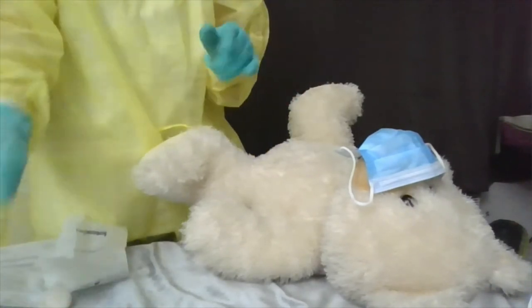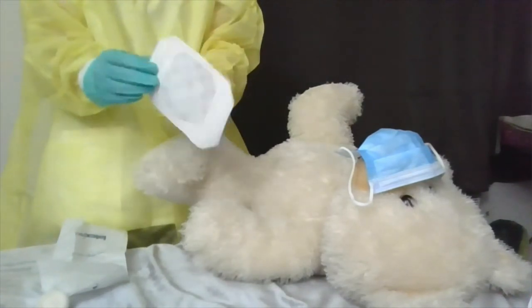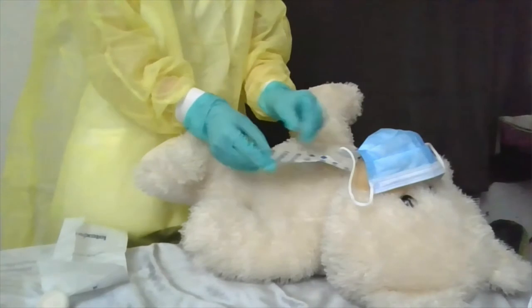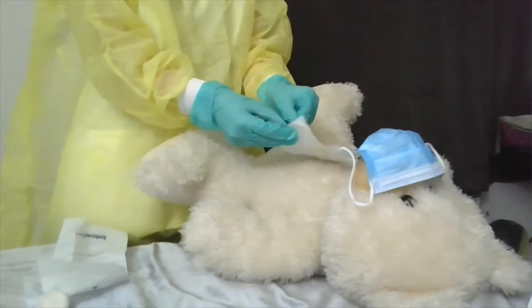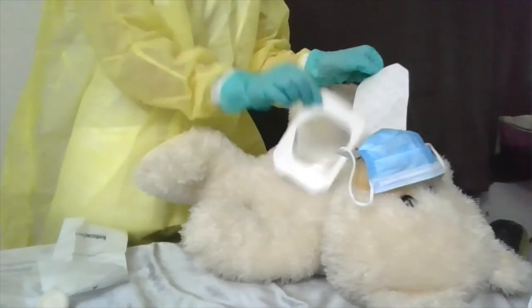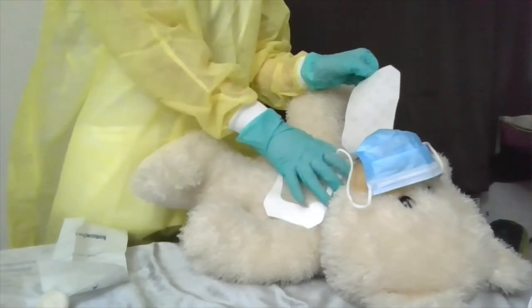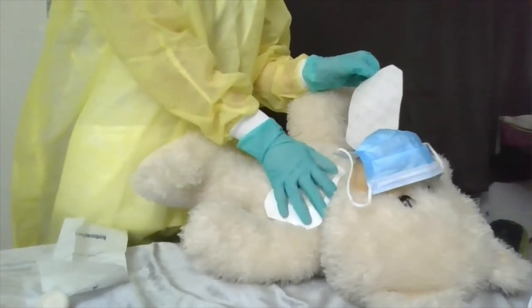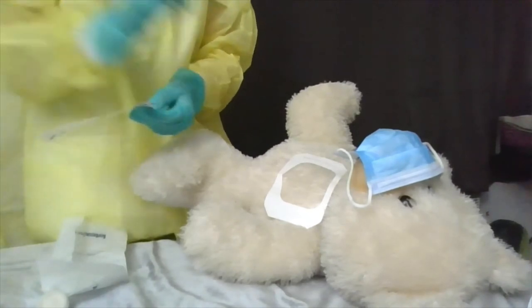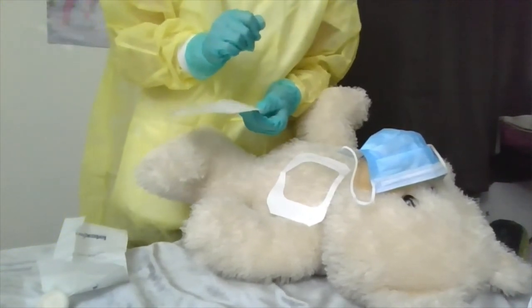Now I'll apply my new dressing. I have my clear dressing here. I'm going to place it over the central line site. Then I'm going to make sure that I date it — I put the time and my initials on the dressing.